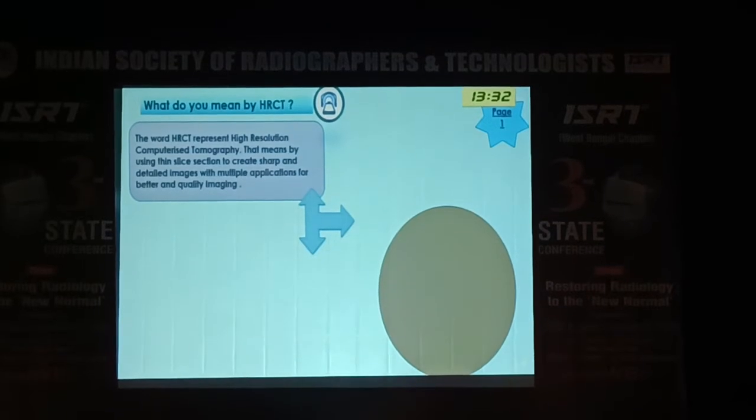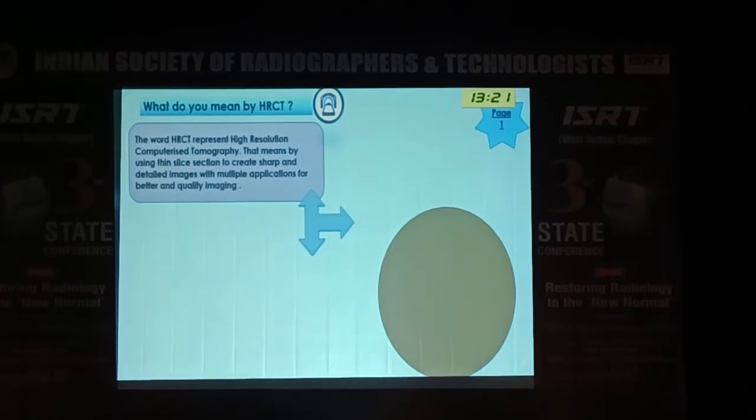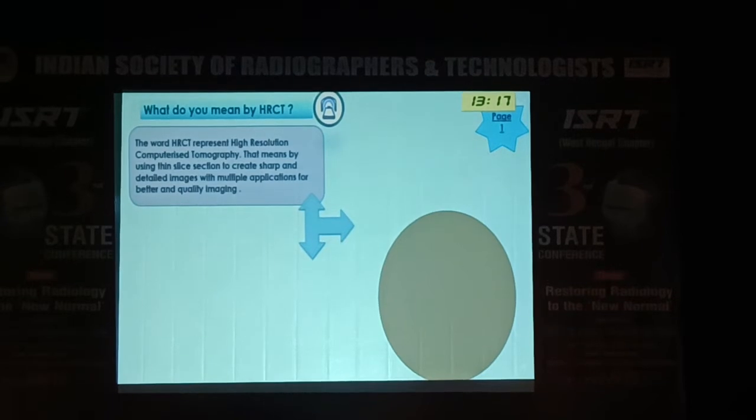There is a part in the area called the scutum, which is mostly affected by CSOM, chronic suppurative otitis media. In that case, if there is a minute change or erosion, that is called cholesteatoma, the topic of discussion of today. So we have to be very detailed in that kind of imaging.